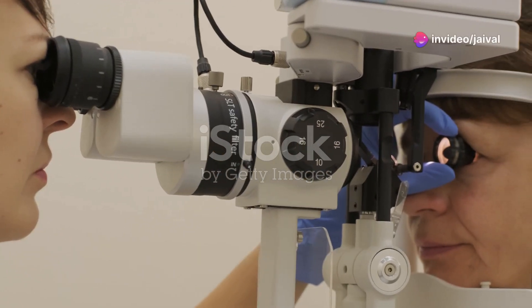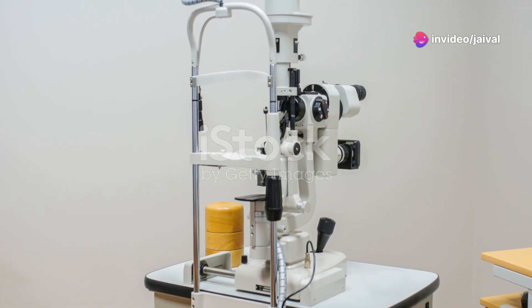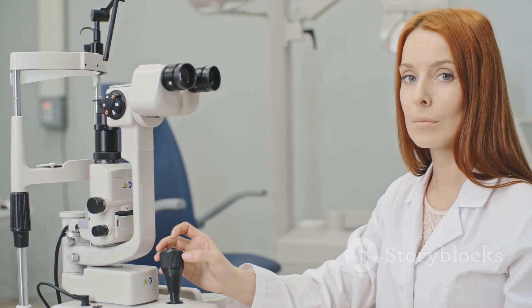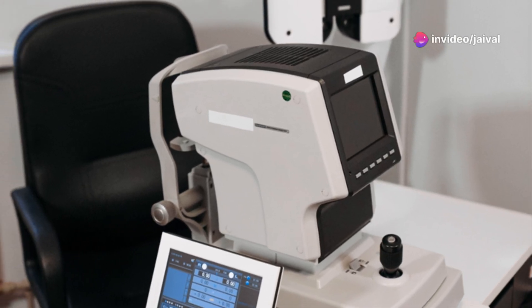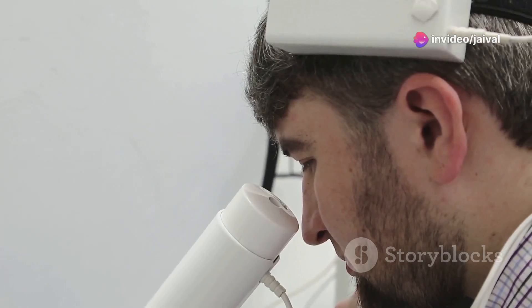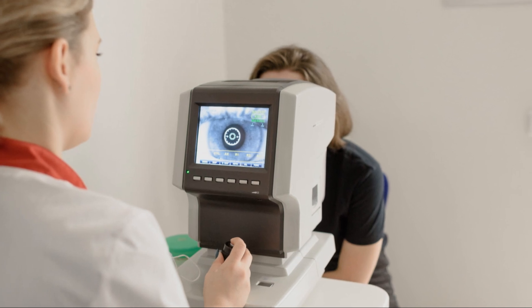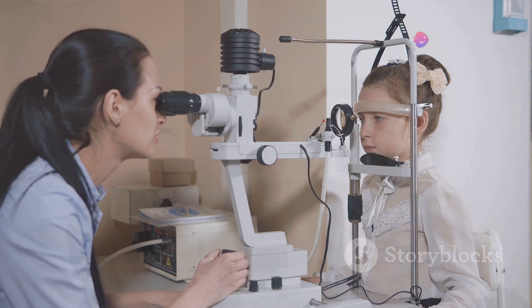The corneal wedge technique offers a quick alternative to gonioscopy. Direct a narrow beam of light at the corneal limbus using a slit lamp and observe the illumination pattern in the anterior chamber. Assess the ratio of corneal thickness to the illuminated area — a wider illuminated area suggests a wider angle. This technique is useful when gonioscopy is challenging and provides a valuable screening tool for angle closure risk. Confirm suspicious findings with gonioscopy when possible.